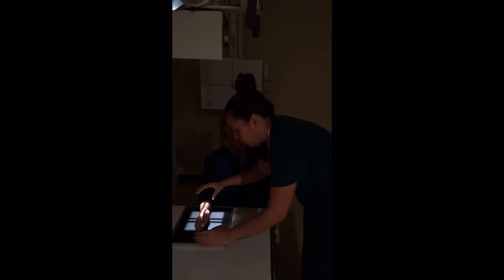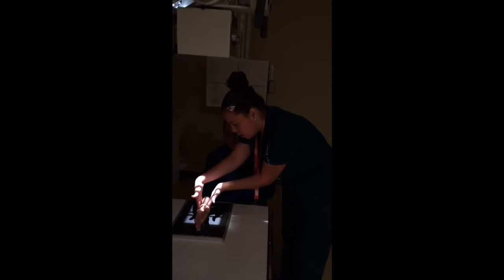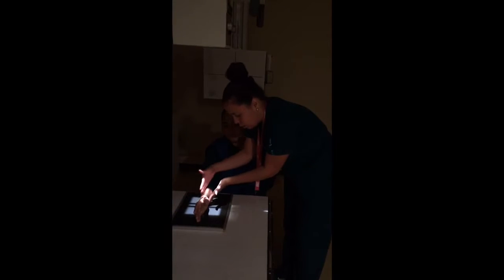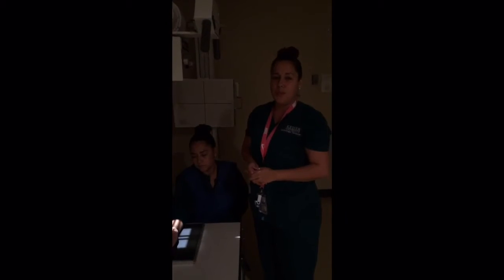And the last view is going to be a lateral. So what I'm going to have you do is just go ahead and place your hand in a karate chop position right there. So what I like to do is go ahead and put my hand on the side of the wrist and make sure that it's parallel, so that the radius and the ulna will end up being superimposed over one another. Right there, center it. And once again, direct to the mid-carpals, and we can close collimation towards the mid-carpals, and we want to see a portion of the radius and the ulna. Well, that ends the first set of the routine exam for the wrist.